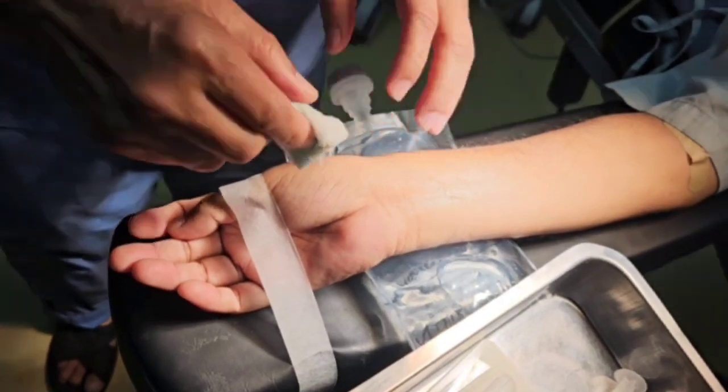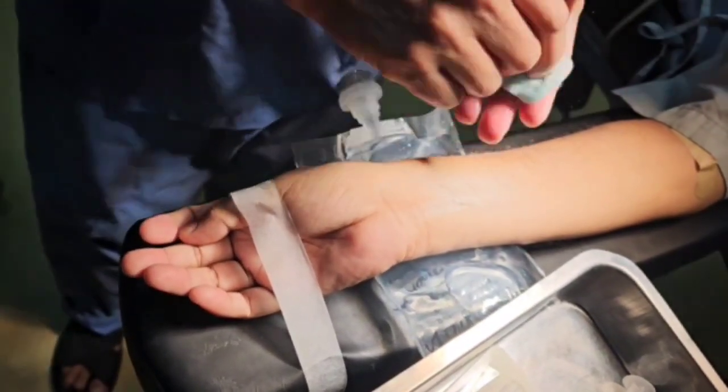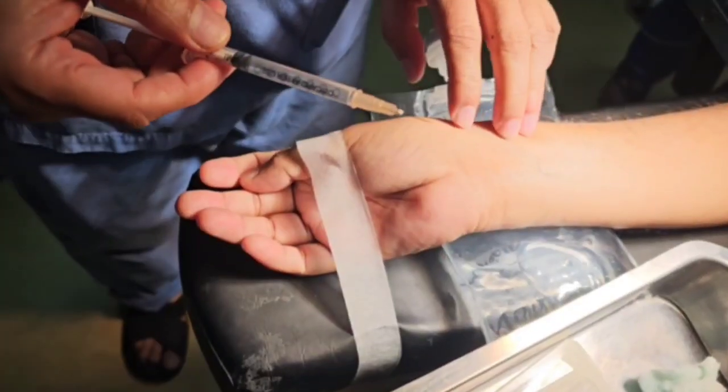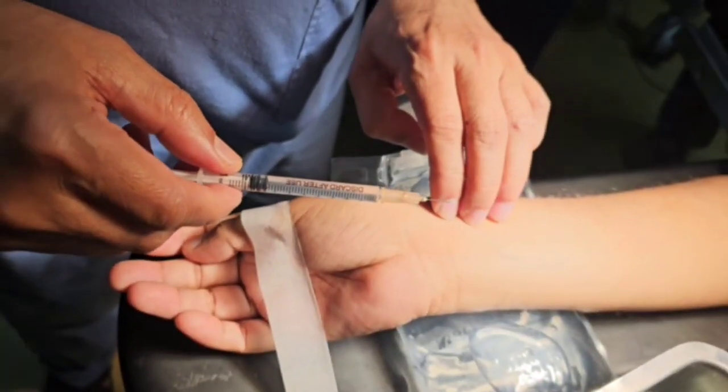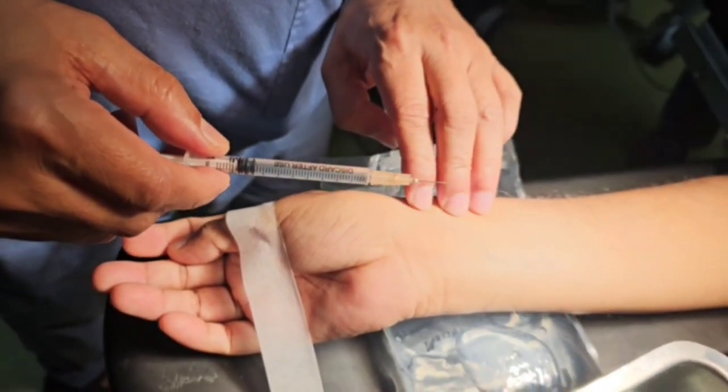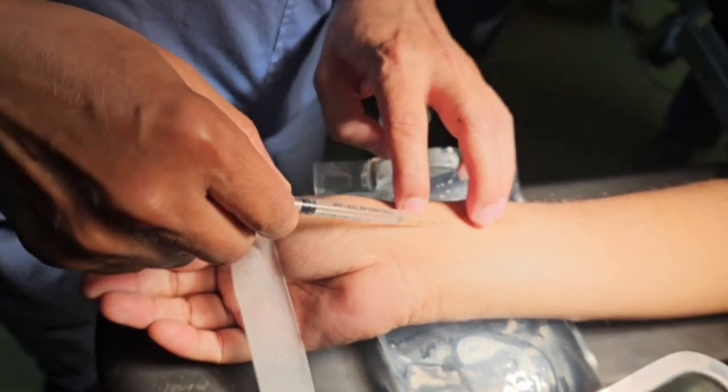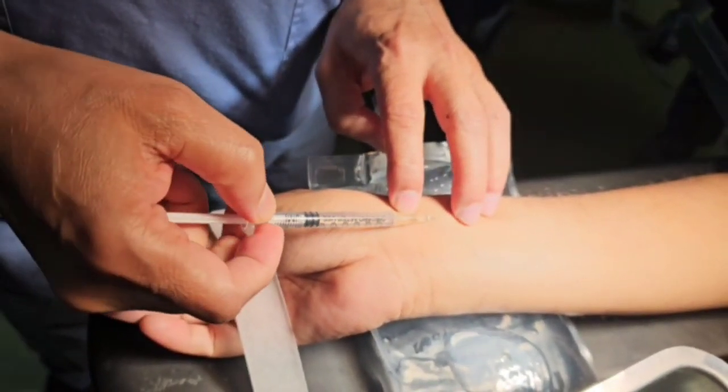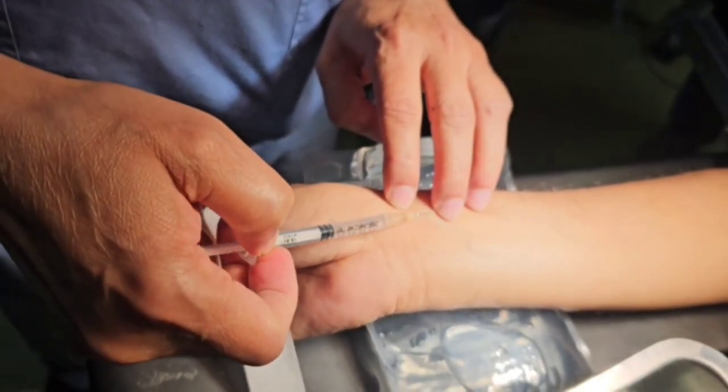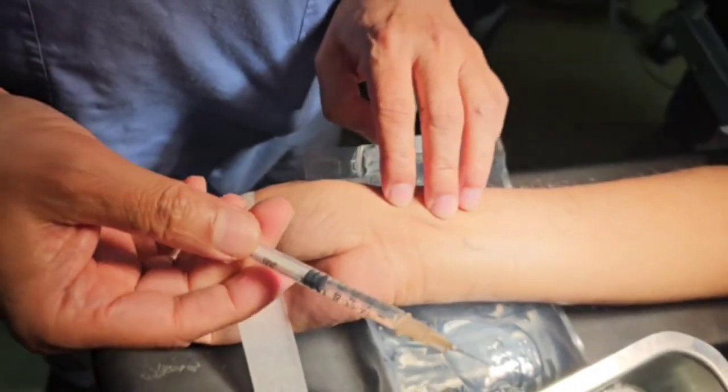Then we need to make a small wheal of 1% lidocaine to decrease pain during cannulation and reduce the occurrence of arterial spasm. Sometimes the catheter may not easily pass through the skin. To overcome this, we need to make a small nick on the skin with a needle or blade at the insertion site.